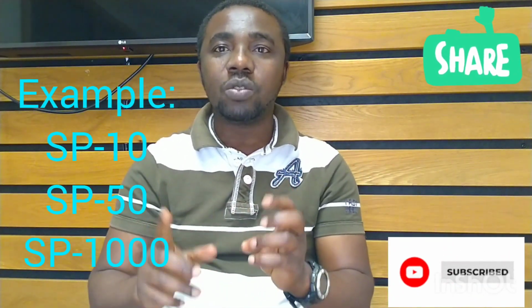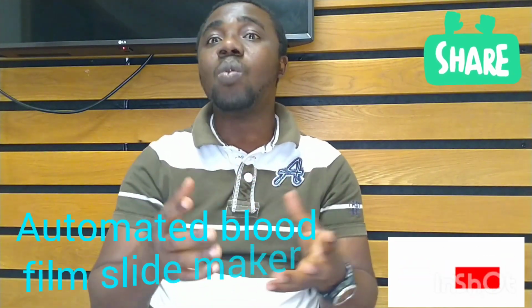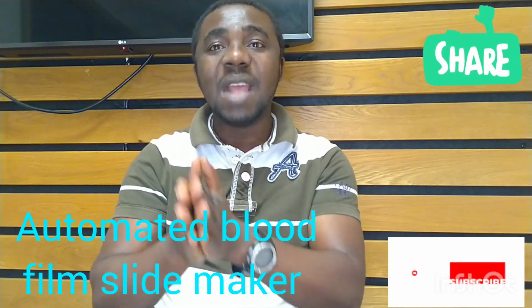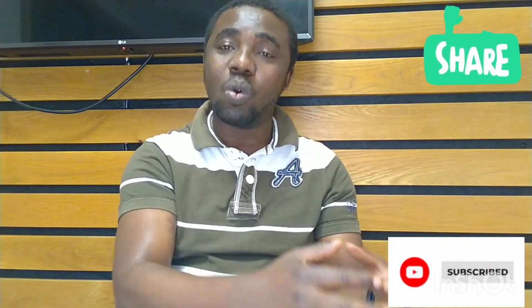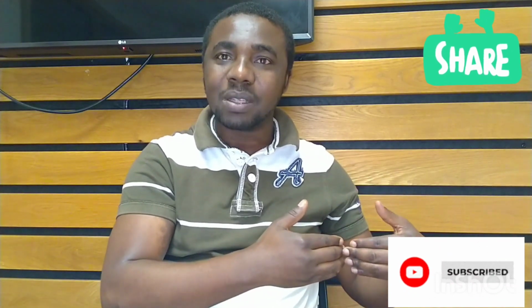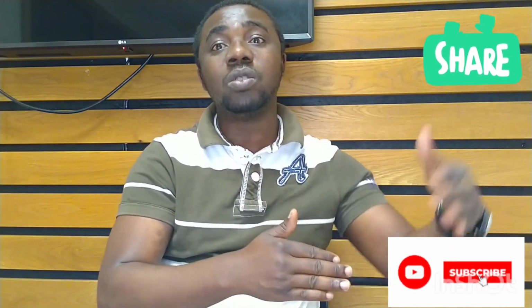So far I've mentioned two. I've mentioned Sysmex XN, maybe like 9000, 9010, and so on. Now I've mentioned something like SP10. This SP10 is the one that we use for making a blood film if the analyzer thinks that a blood film is required. Once the blood film is made and it's finished, the rack will come out. Once the rack comes out, it can then go back to the line and be transported to the tube sorter.